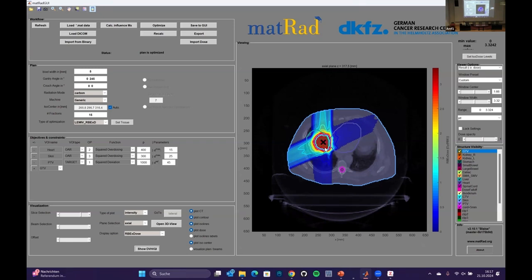Then they have lighter fragments and they have a different range, basically because their atomic number is different, and there are quadratic dependencies in these. The range changes. They have a bigger range. They lose energy more slowly per nucleon. So you have this fragmentation tail where these particles then lose the rest of their energy.